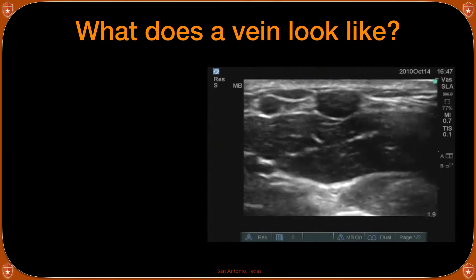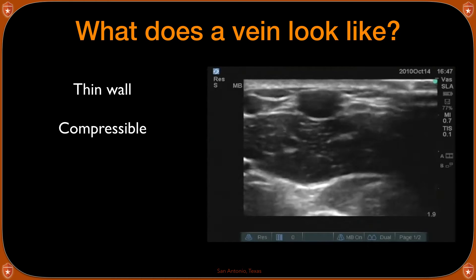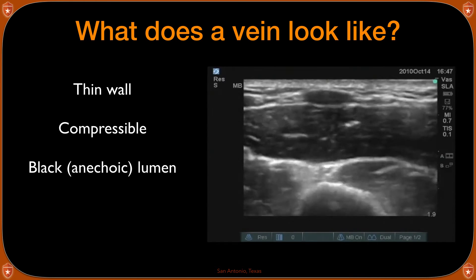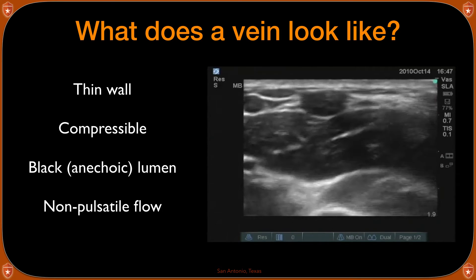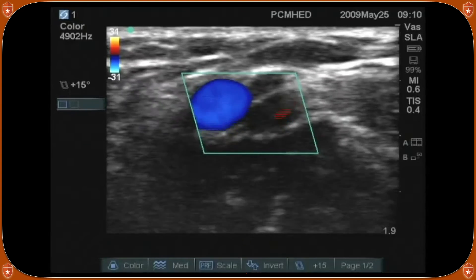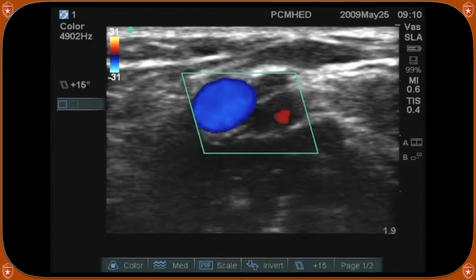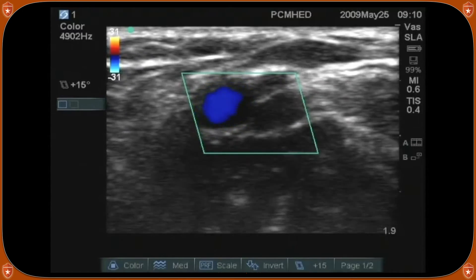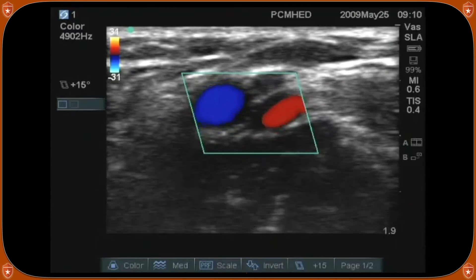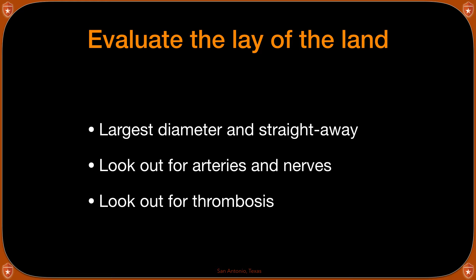When investigating a vein, make sure it is actually a vein. A vein has a very thin wall, is very easily compressible, the inside looks black or anechoic, and it has non-pulsatile flow. If you're not sure whether a vessel is an artery or vein, apply color Doppler to see the flow. Blue and red don't stand for vein and artery — they indicate flow direction away from or toward the probe. You're just looking for pulsatility. Look for the largest diameter vein and straightaways — avoid tortuous vessels.